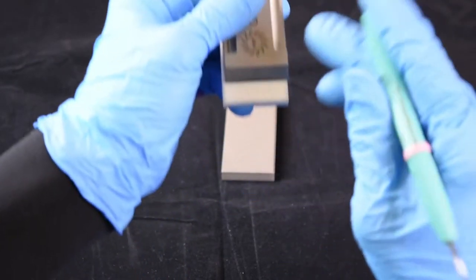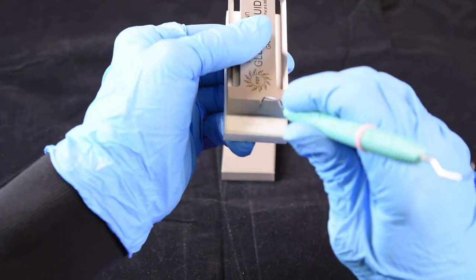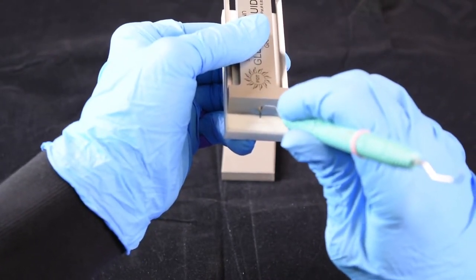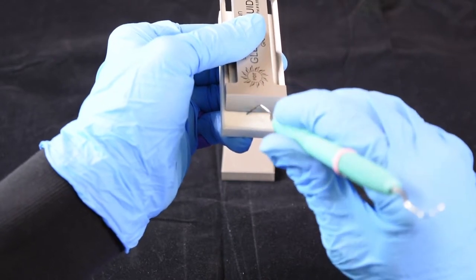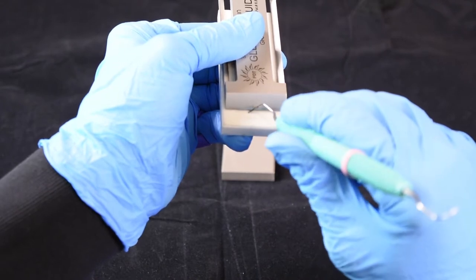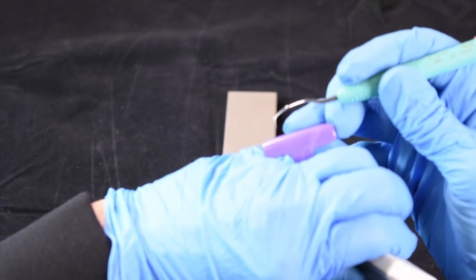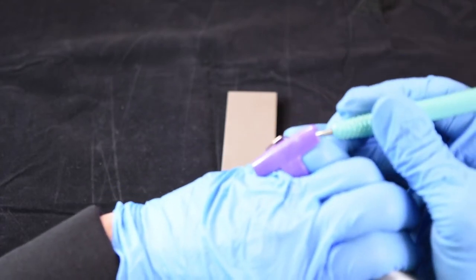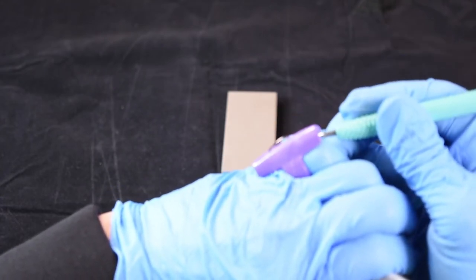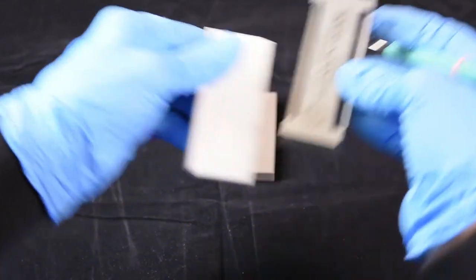Then to sharpen the toe of the instrument, we glide down and roll, and check the sharpness. You can hear the ping, and the blade is ready to go.